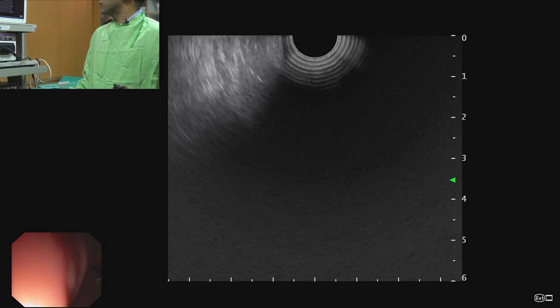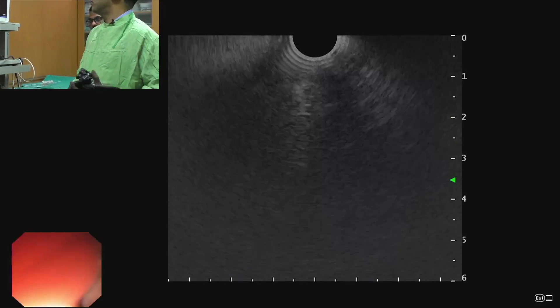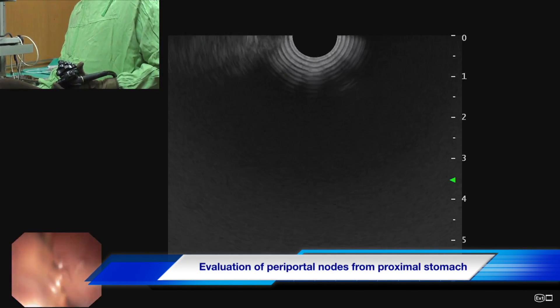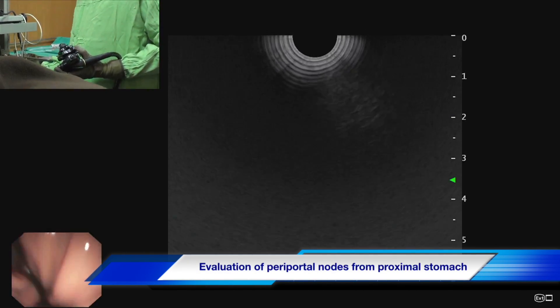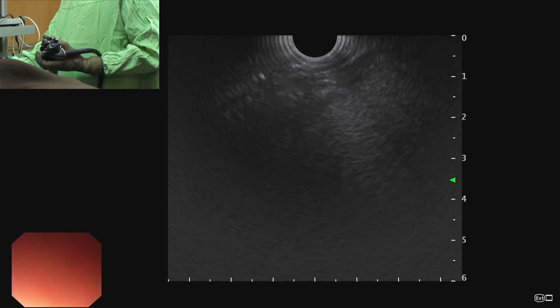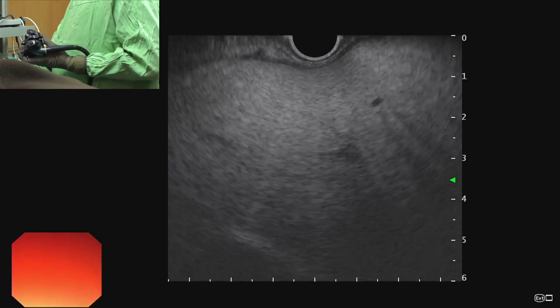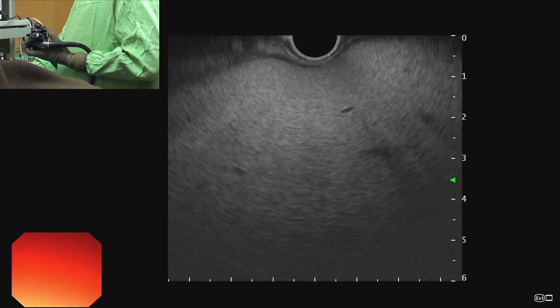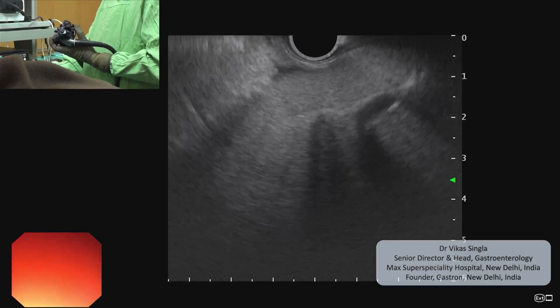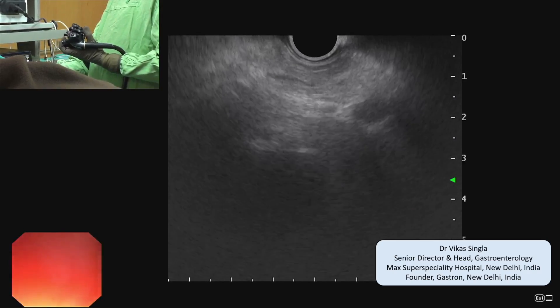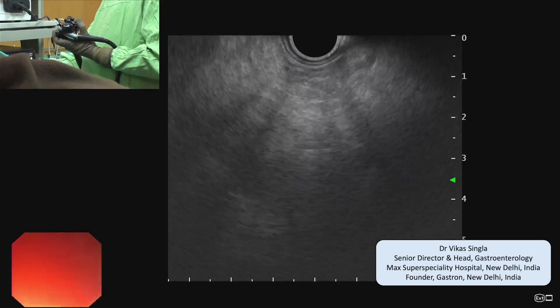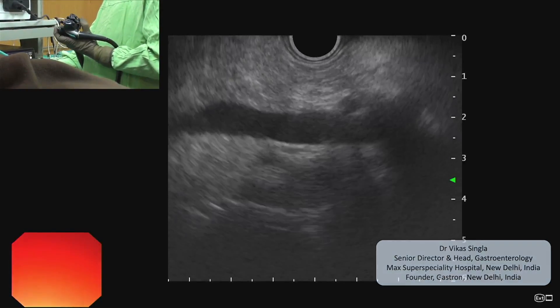First we focus on periportal nodes that can be seen from the proximal stomach. Our left hand should be facing up and the scope is in the proximal stomach. Then by using the up knob we can scan the left lobe of the liver. Then by giving a clockwise torque and raising our left hand, we can see the formation of the portal vein.